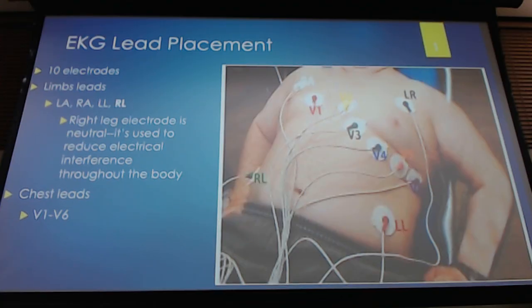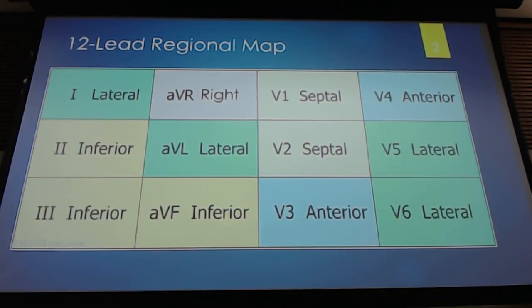Okay? And then the precordial leads, those chest leads, we talked about how those go. V1, V2, 4th and 5th intercostal spaces. Those are the only intercostal spaces we're using, but it's whether it's next to the sternum, mid-axillary, mid-clavicular, anterior axillary. Those are the different places for your chest leads and your precordial leads.